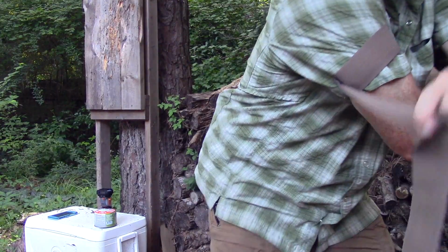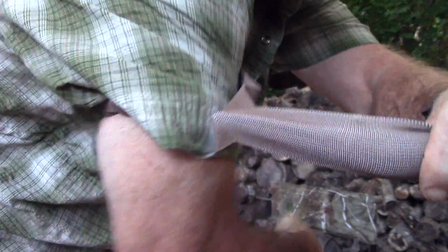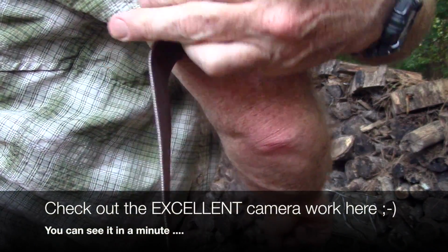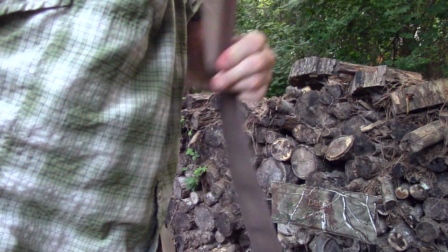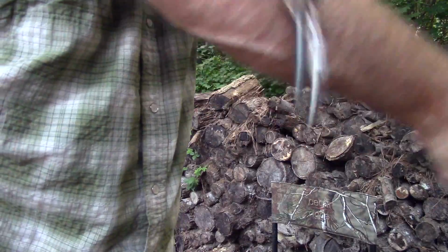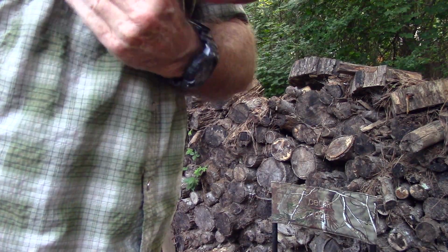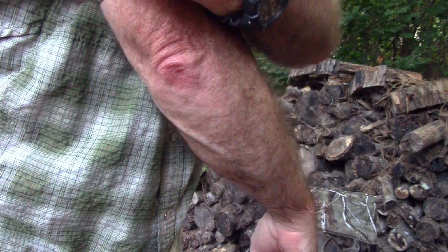So you're doing this right here. Can you see that? I'll get where you can see it. You've got the hook around it, and just pull it backwards, right? Pull it backwards this way, and pull it really tight. Okay, so loop it around like so, where it slides through, pull it really tight, and then pull this whole thing tight and around like so. When you get it as tight as you can, you just hook this hook back into itself like so.